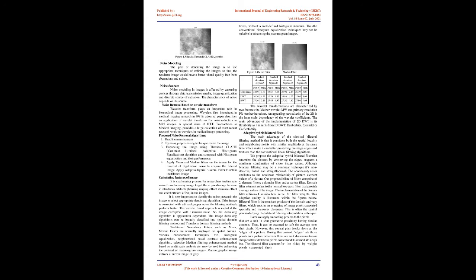The aim of contrast enhancement is to increase the contrast of microcalcifications over the threshold and help identify the minute microcalcifications. The first step in the study of mammogram images, image enhancement, is denoising the image.